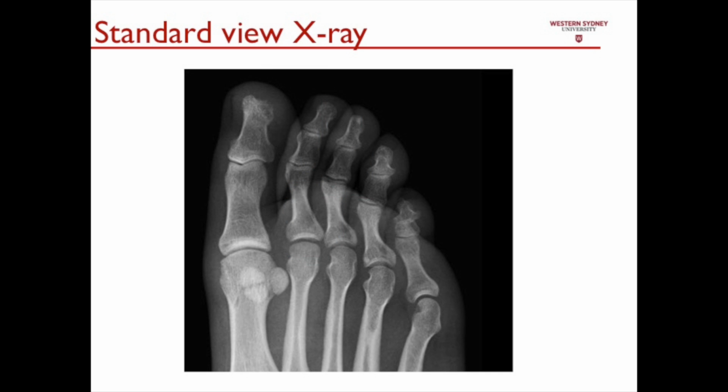In this image we can see a standard view of the forefoot. So you will see that we see a nice outline of the skin on the lesser digits, and you will see that we have a good appreciation of the metatarsal phalangeal joints and all the interphalangeal joints.